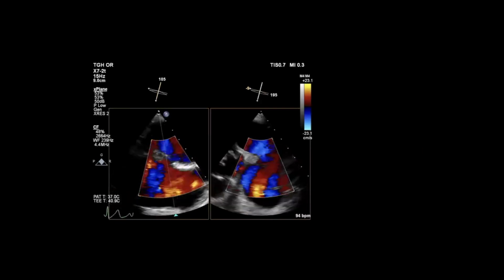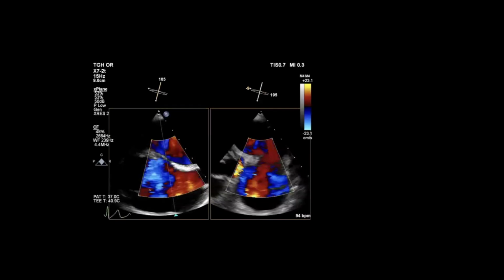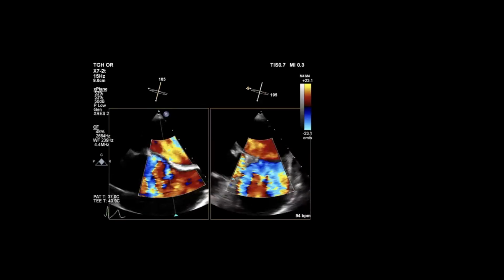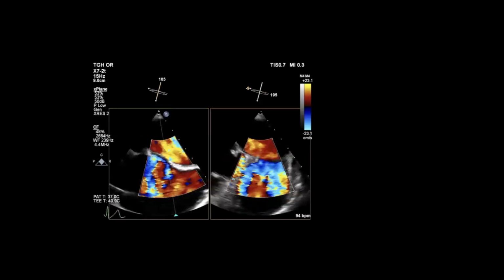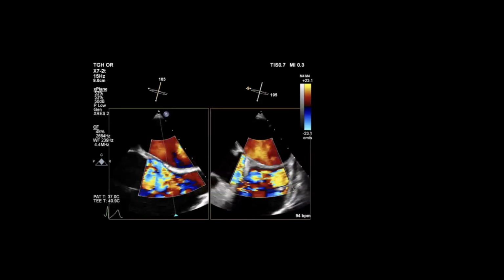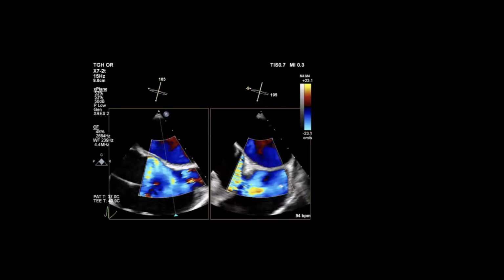It was contained at least, otherwise it would be catastrophic. There was hematoma in the mediastinum that had clotted. So this chest pain was basically from rupture, not dissection. Rupture of the sinus of Valsalva can actually lead to chest pain. Exactly.